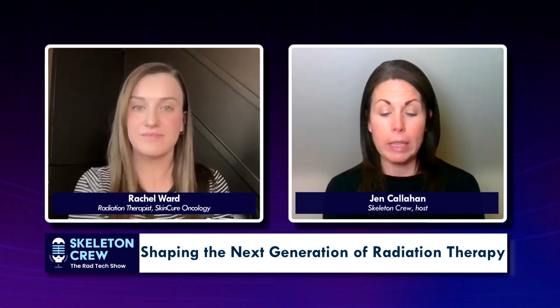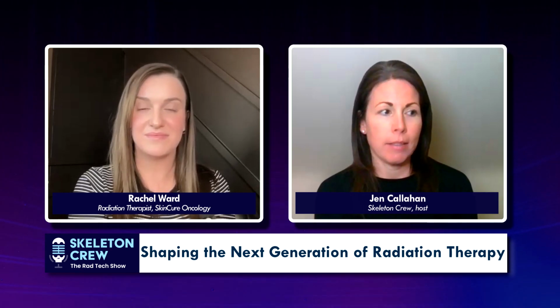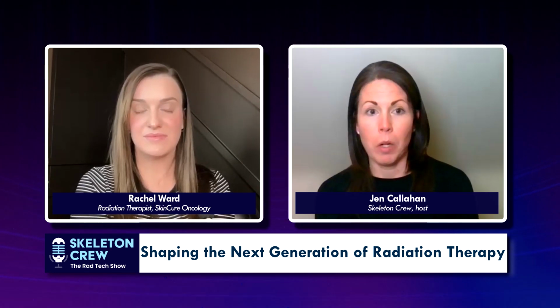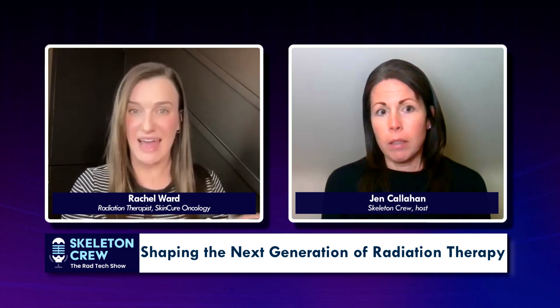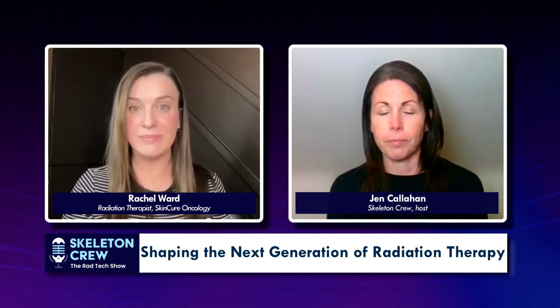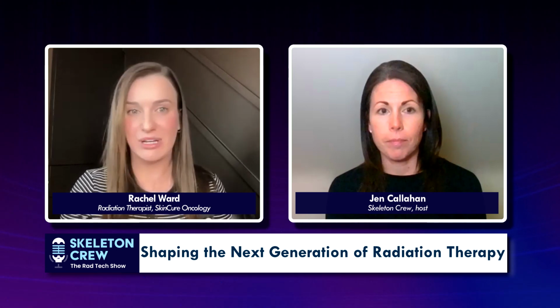For those of you who are listening and aren't sure what she was saying in terms of kV, it's a technique factor that we use for X-ray and radiation. And basically, it's how fast your beam comes out. So we're saying kV is kilovoltage, and then MV, I guess, for other types of cancer treatment. What is the measure? So for radiation therapy, we're using kV energies. They're going to penetrate a lot less. A 50, 70, and 100 kV beam is only going to be about the thickness of the skin. We're not getting much depth with that.